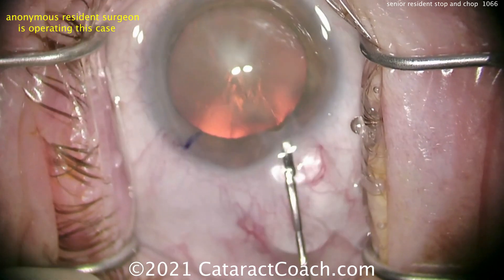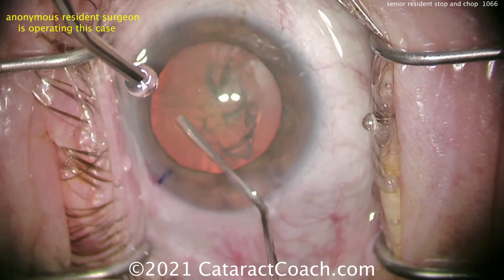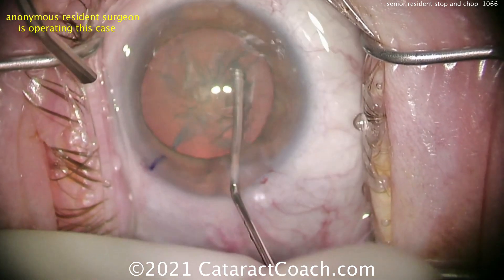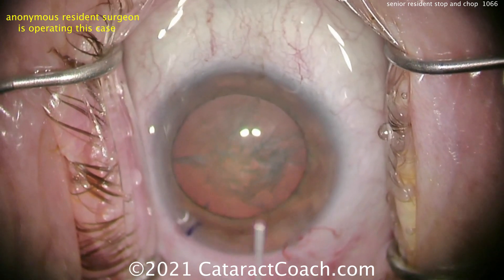Let's see the hydrodissection. Letting out a little viscoelastic — I don't usually do that, but that's okay, you can do that. A little bit of hydrodissection here. Let's see a good fluid wave. And it does start to rotate. Remember my saying: if it does not spin, you will not win. This is spinning, so you're going to do fine.